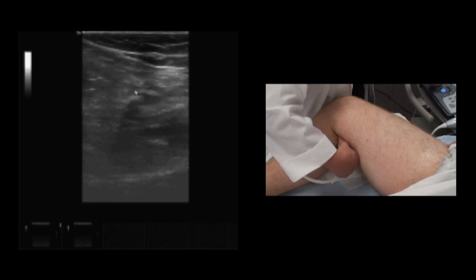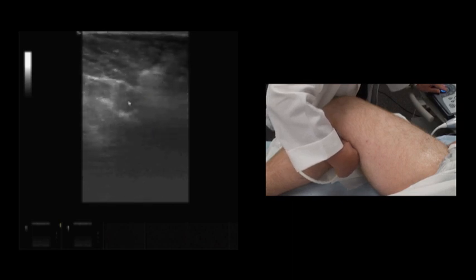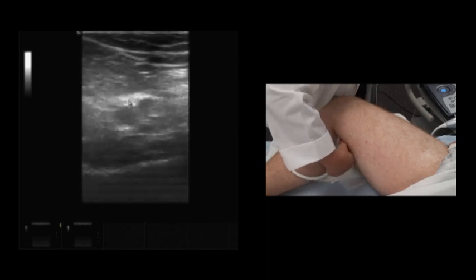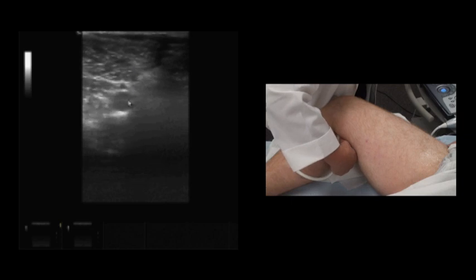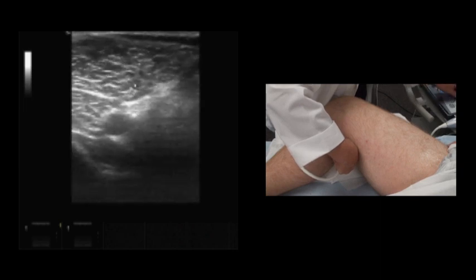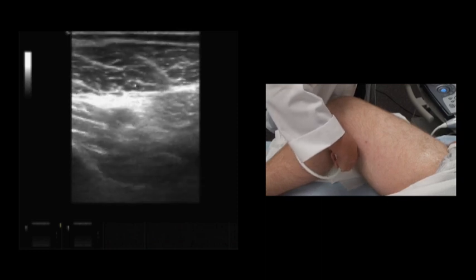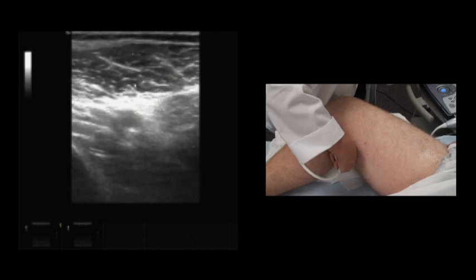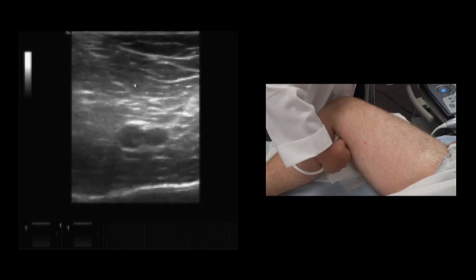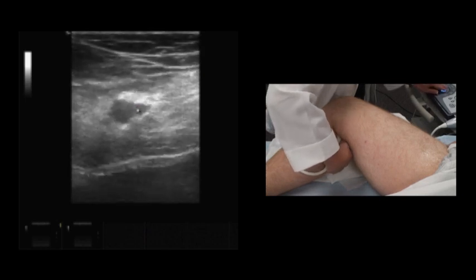And then scanning inferiorly, we once again see the popliteal vein and the popliteal artery. And we want to completely collapse. Scanning inferiorly, we see the trifurcation, small vessels coming off. And we want to make sure that those completely compress as we continually scan. Slightly inferiorly, moving back superiorly, and they re-empty into the vessel.